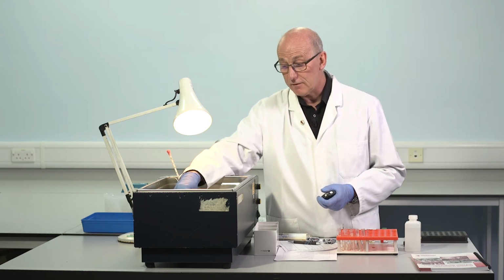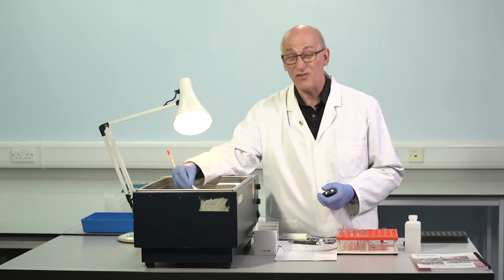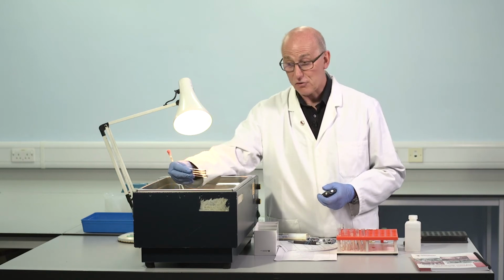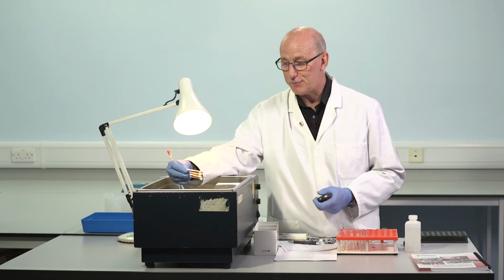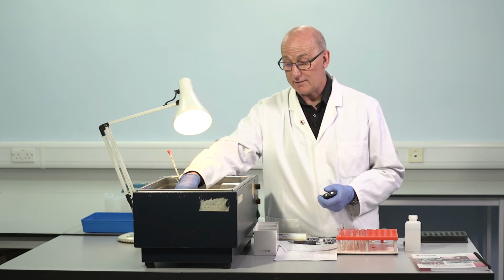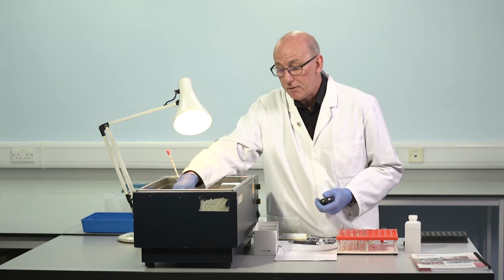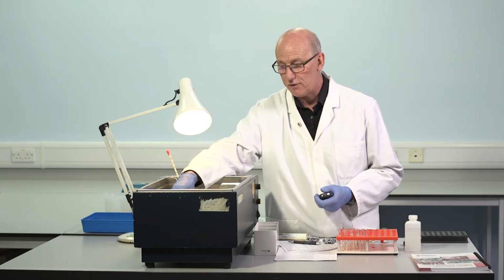So I think that it's a good recommendation in my opinion, and that's the reason why it's a consistent recommendation in all of the guidelines written in this area to the best of my knowledge. It's certainly there in the WFH lab manual, and I'm confident we'll retain it in any future editions. If you ask the centres who do a single test dilution, why do you do this? The most frequent reason that's given relates to cost. People say, but I don't want to spend the extra money on those extra dilutions, extra reagents.